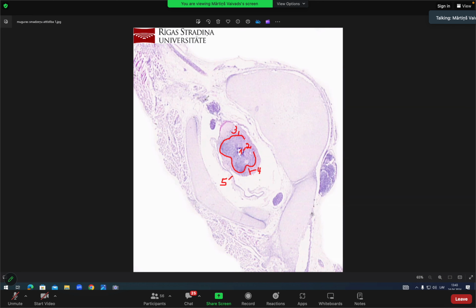What else is here? You might spot dark groups of cells sitting next to the spinal cord. Also, this belongs here. This is also number 6. Developing spinal ganglions. That also appears in this slide. We will see separate spinal ganglion slide also, but this is here as well.